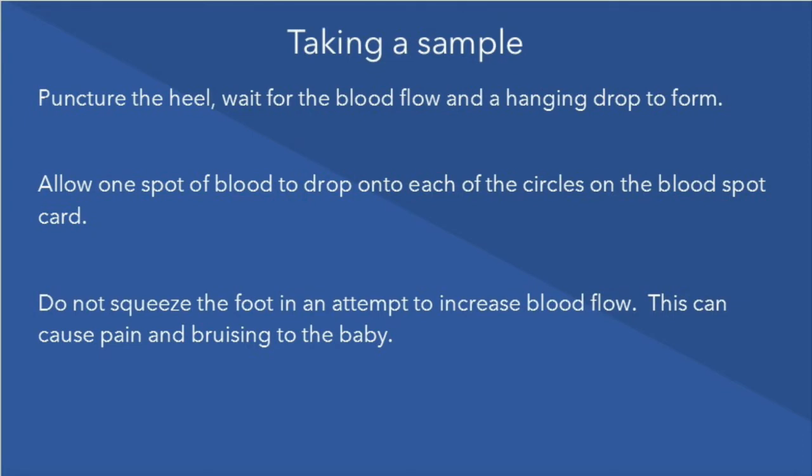The heel should be completely dry before the sample is taken to comply with infection control guidelines. When taking a sample, trigger the device, wait for blood flow to start and a hanging drop to form. Allow one spot of blood to drop onto each of the circles on the blood spot card. Do not squeeze the foot in an attempt to increase blood flow, as this can cause pain and bruising to the infant.